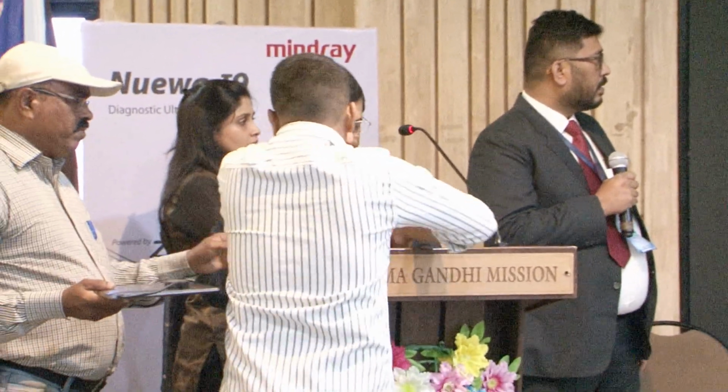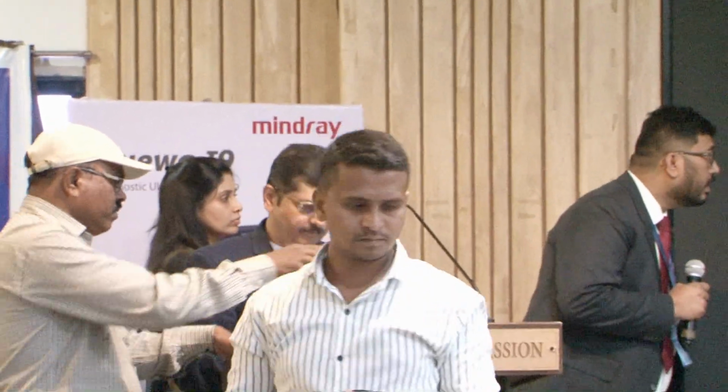Sir, are we supposed to mention the volume of each and every calculus we see? In such cases, it becomes difficult for us to mention the volume. Not for the 2-3 mm stones. We are talking about large stones. The large stones should be mentioned. Smaller stones you can just give the size. For larger stones, we need volume.